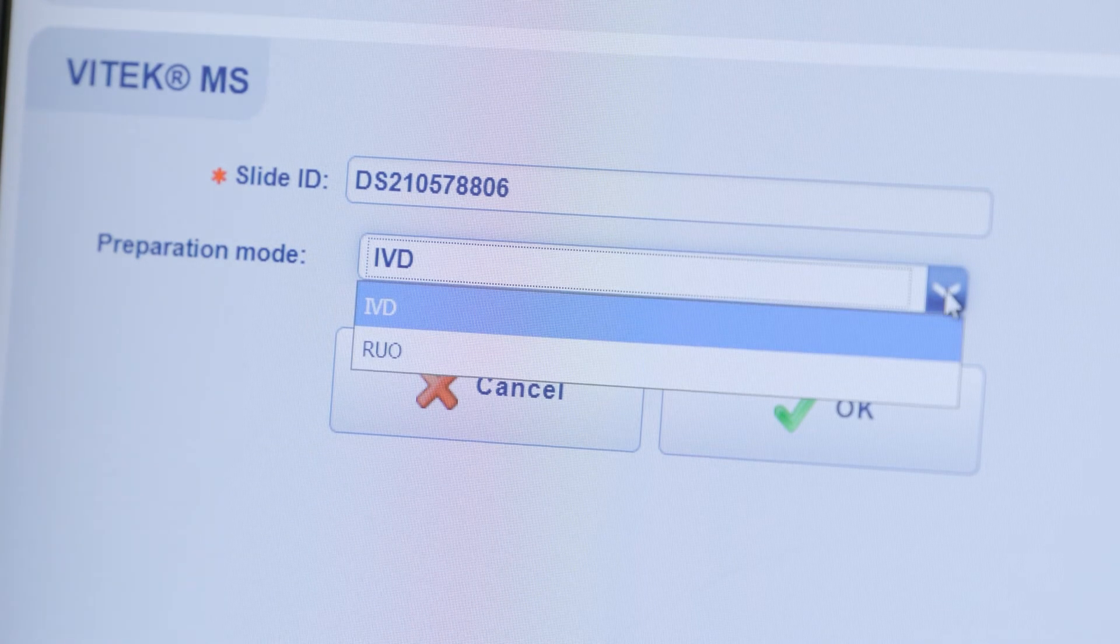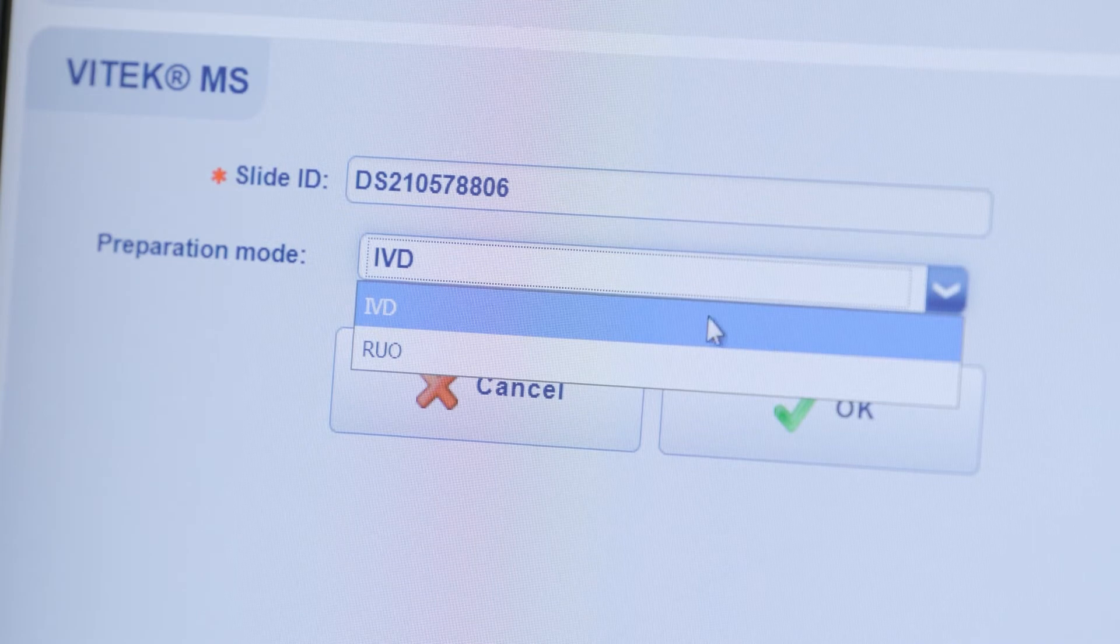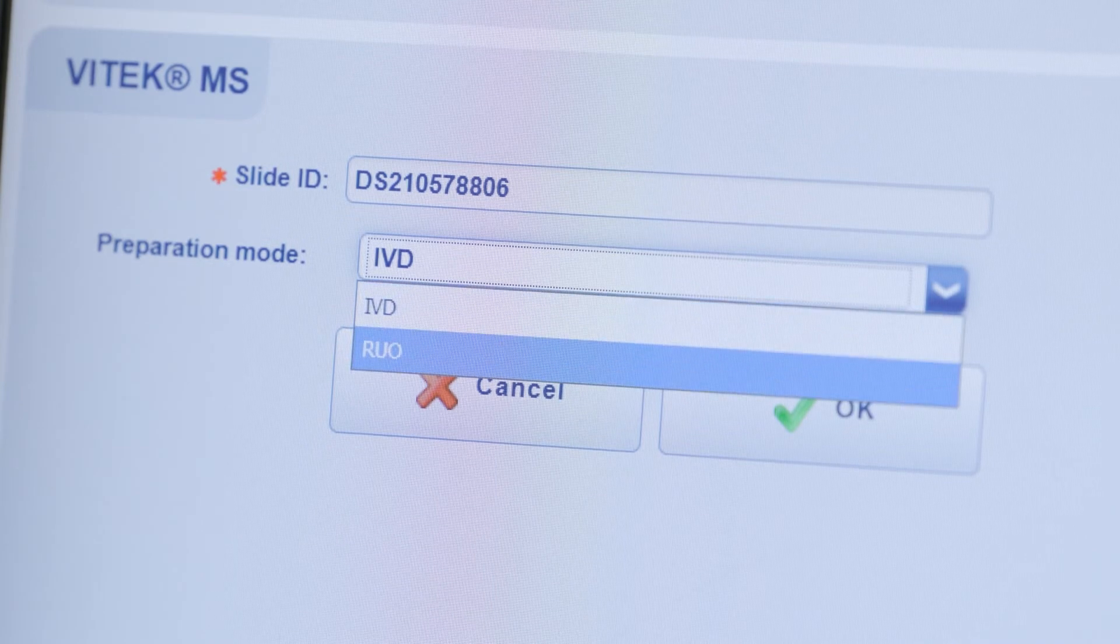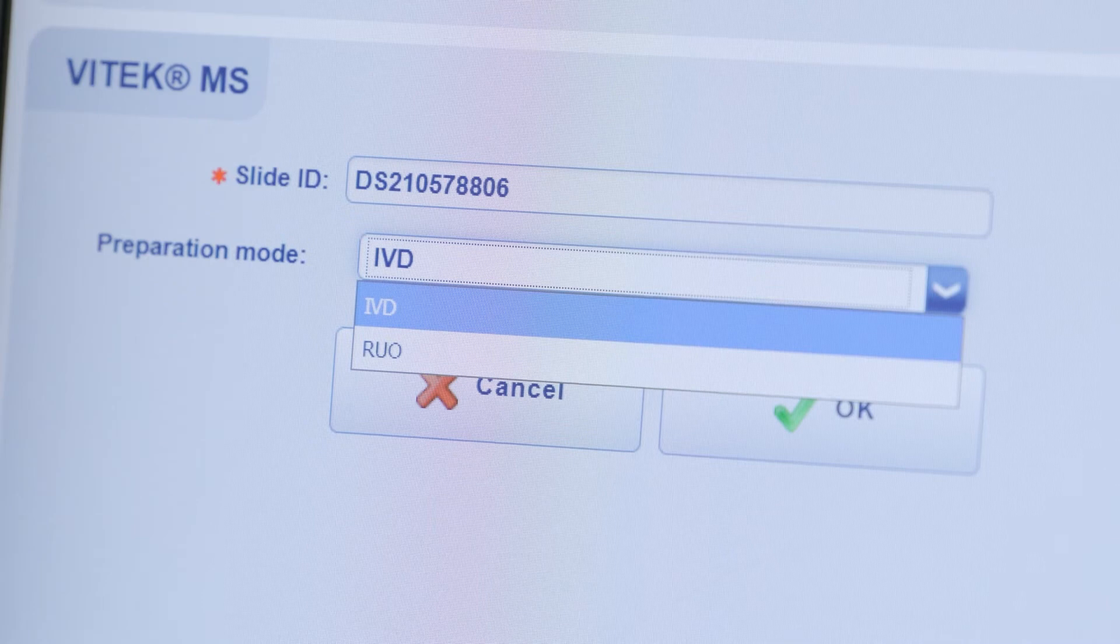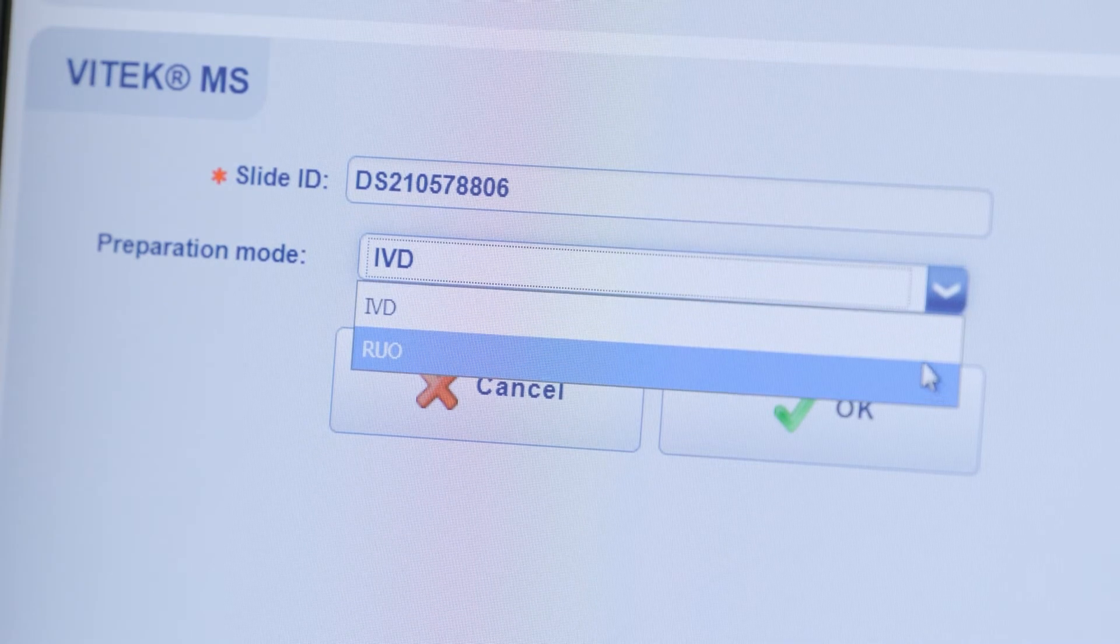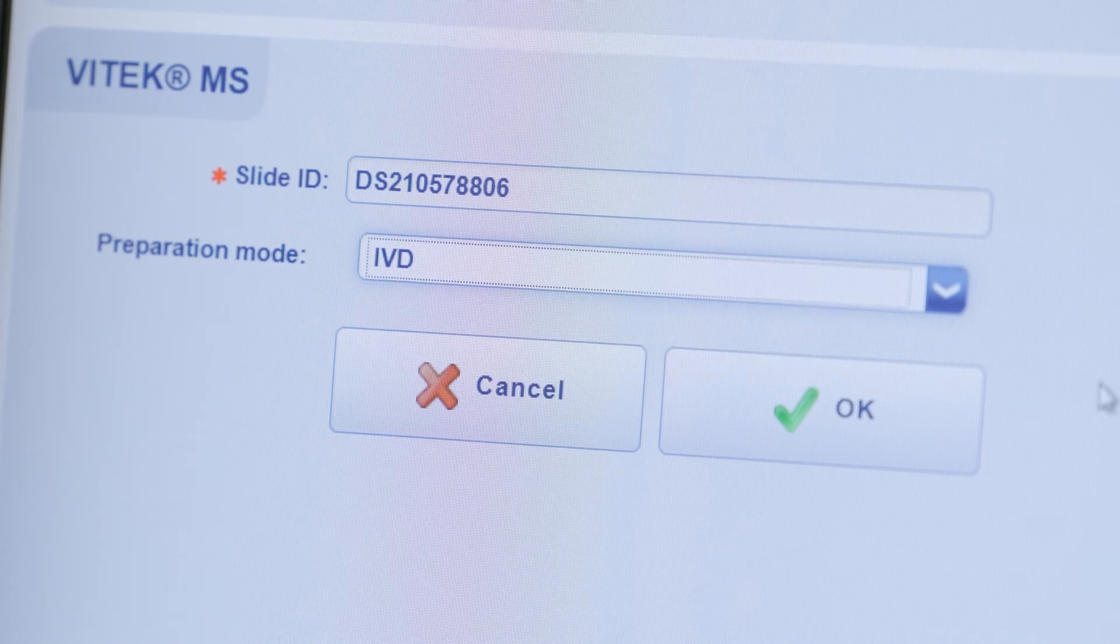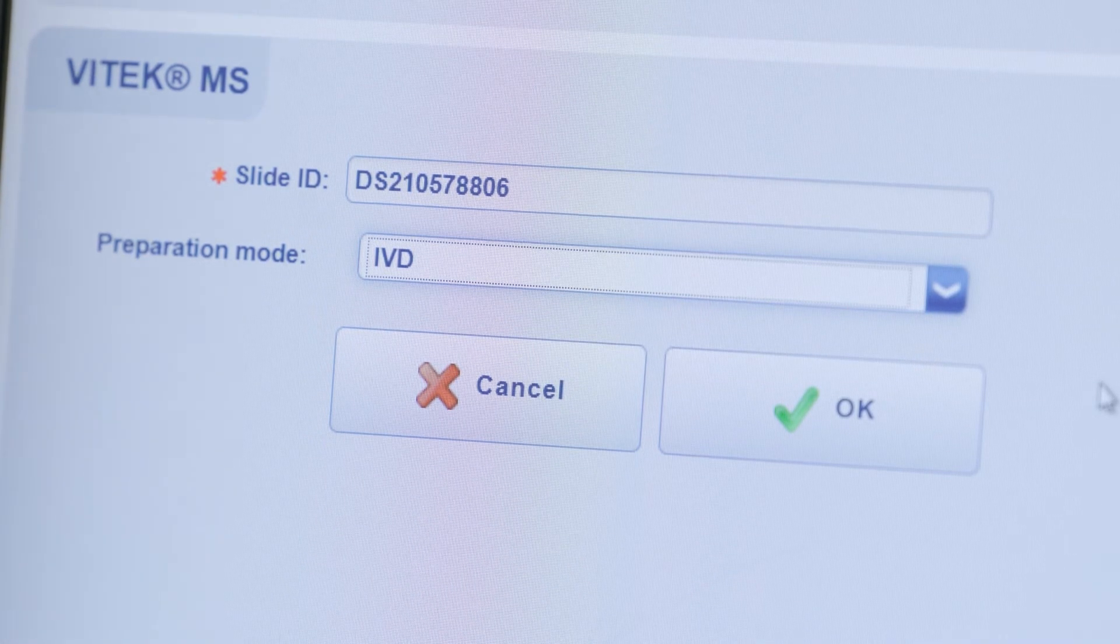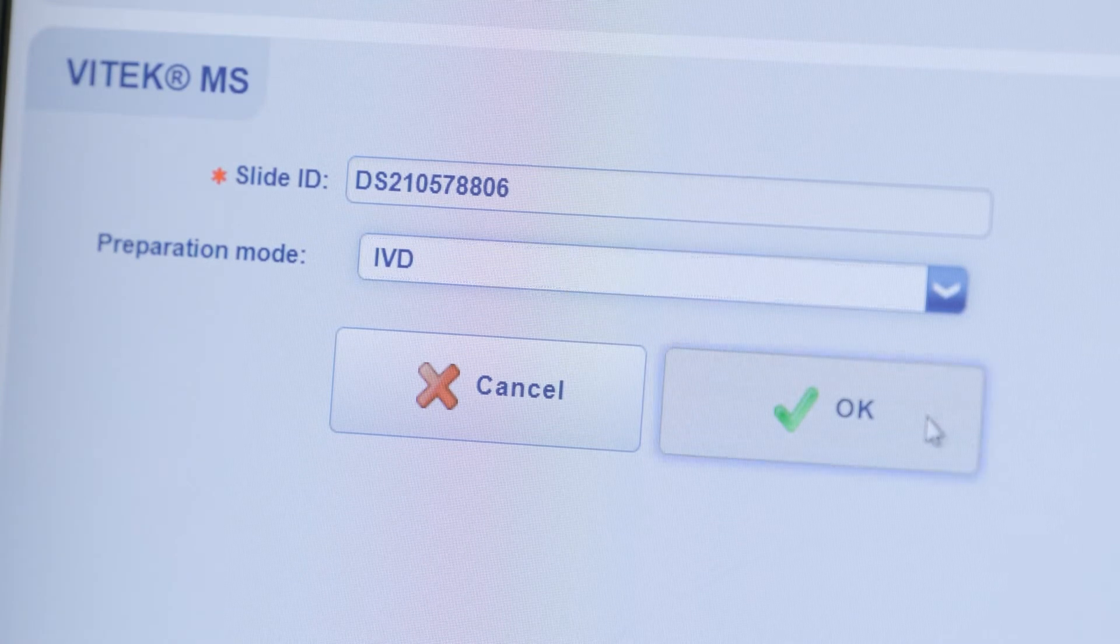If RUO configuration has been installed, two modes are available for slide preparation. For routine clinical use, IVD preparation mode is recommended and selected isolates may be requested for RUO analysis during the review process. Click OK.